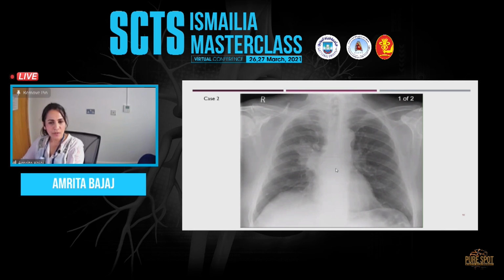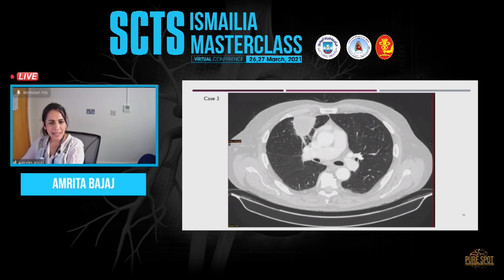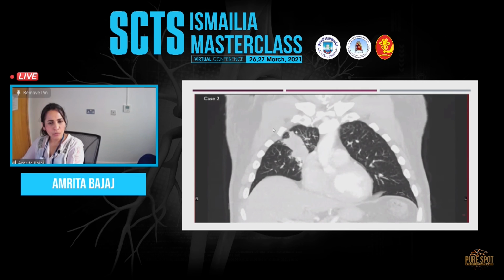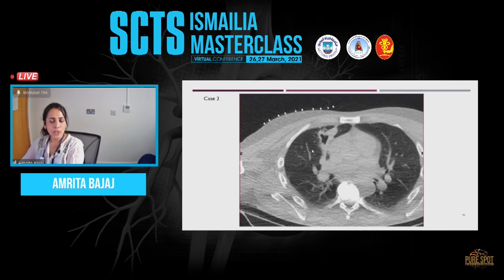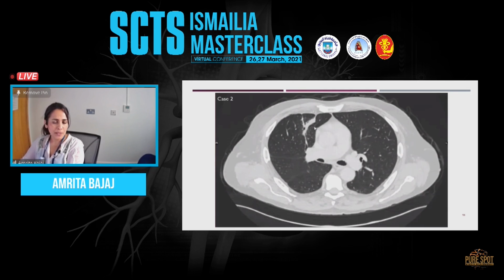This is another patient which I've shown previously, with a large right hilar mass, which was initially thought to be a T2 lesion. On reconstruction, it was thought to be much bigger, a T3 lesion. A PET showed internal cavitation and that it was quite PET avid, but at the time of biopsy it was thought to be significantly smaller. It was then decided not to proceed with the biopsy and to do a follow-up CT. On the follow-up CT, as you can see, it disappeared. So surgery was precluded really.